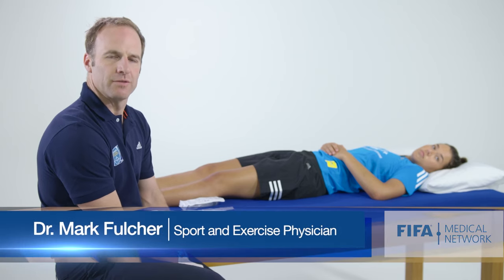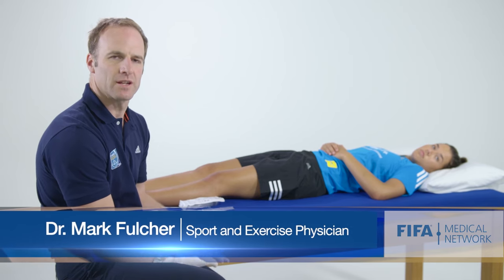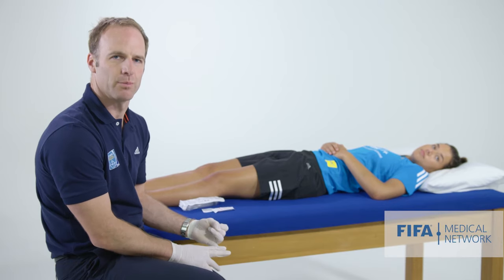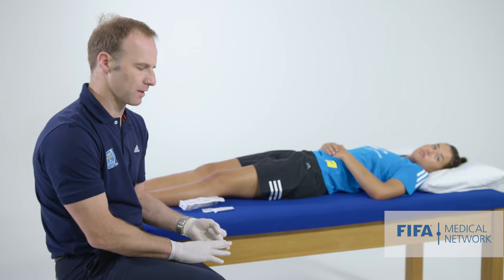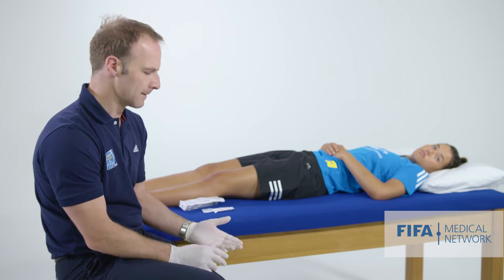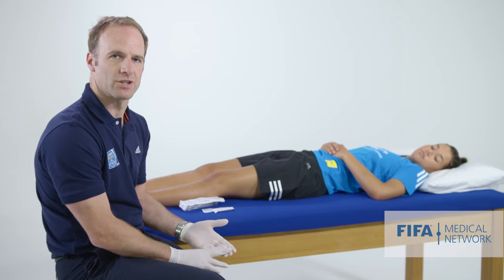When an athlete presents with a very painful swollen knee, it can be very useful to aspirate the knee. This is useful both as a diagnostic procedure — if we aspirate and find blood, we've confirmed a haemarthrosis — and we can send the fluid off for analysis if we think the patient may have an inflammatory arthropathy. The other reason to do this is because it can make the athlete feel substantially more comfortable.